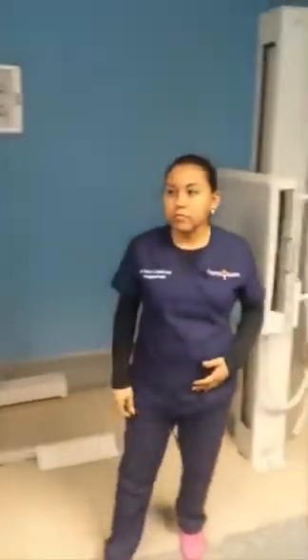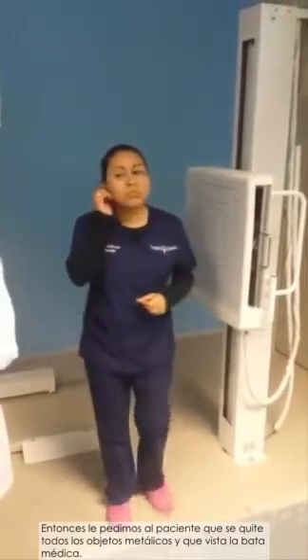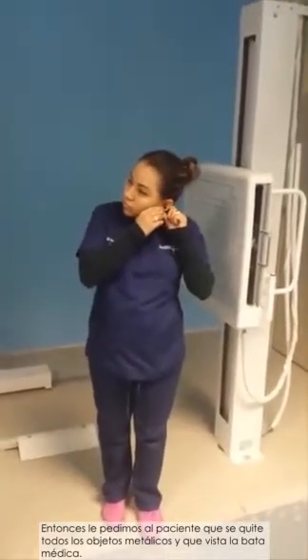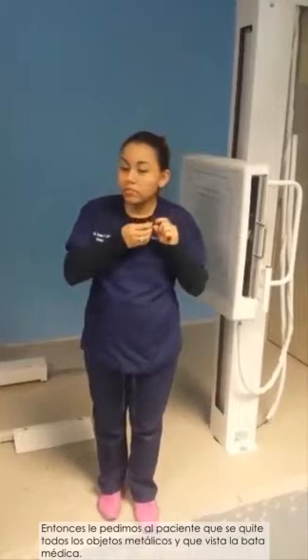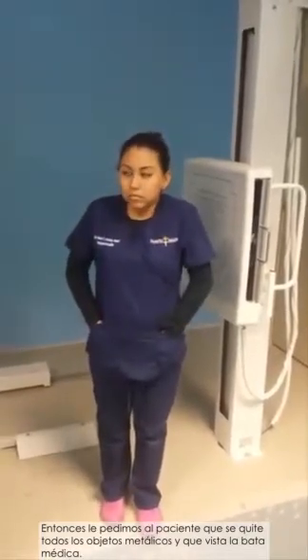Then, we ask the patient to remove all metal objects and wear the medical robe.